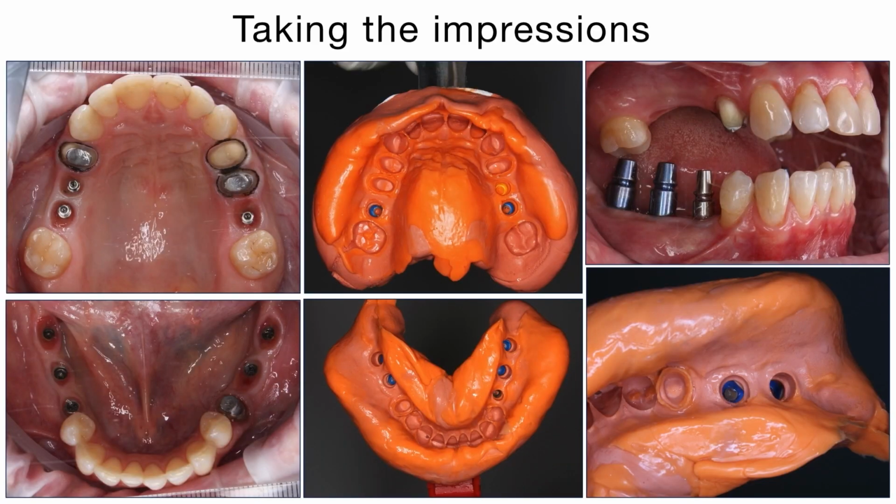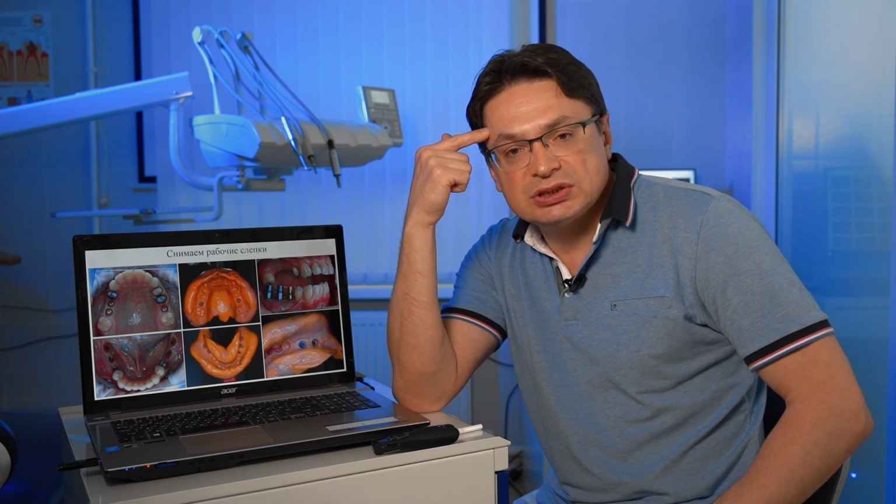So, dear colleagues, once again, what I want to summarize. The first step is diagnostics. Diagnostics is 90 to 95% of your success. You understand what you heal and then you make the right decision. The second step is planning, which is extremely important. It cannot be carried out if you have not made a diagnosis.